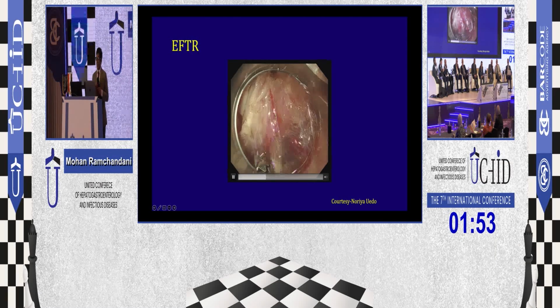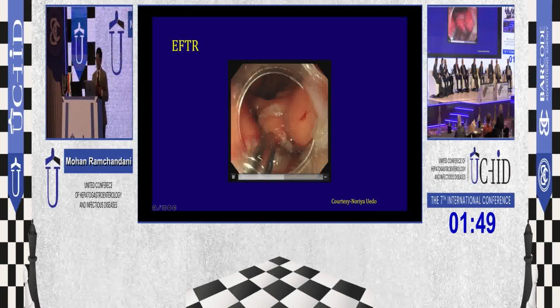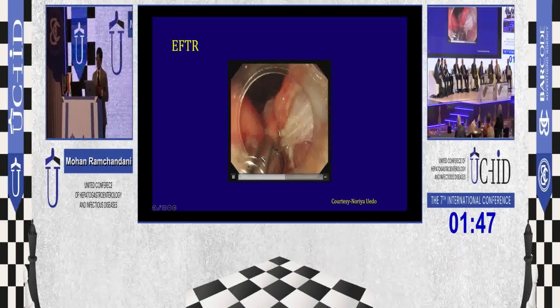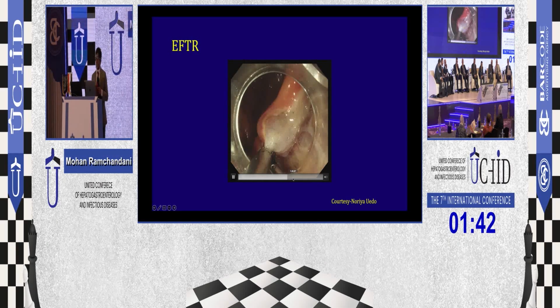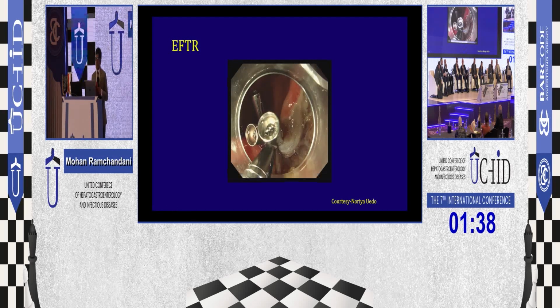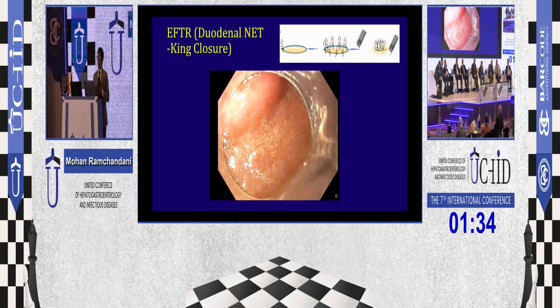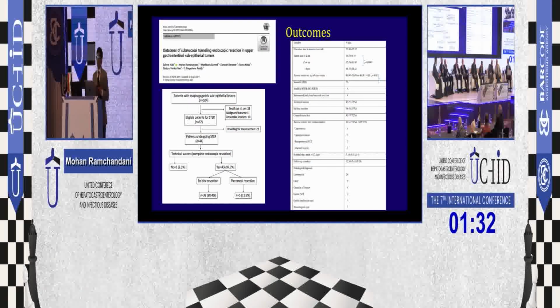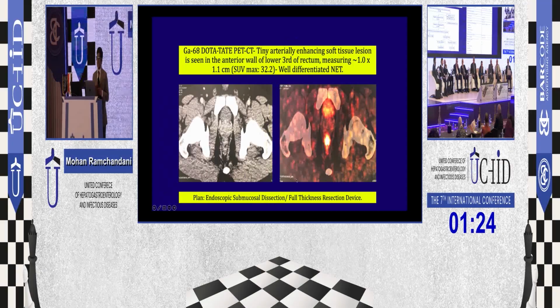This is the outside of the gastric wall, and you can do complete resection, but then subsequently you have to close this full thickness defect. And this is known as EFTR, and this is how the gastric GIST arising from the muscle layer are treated. So that is EFTR. I'll not go into this. So we can remove these tumors based on the diagnosis. Mostly STER is indicated in the esophagus, that is leiomyoma, or gastric GIST.